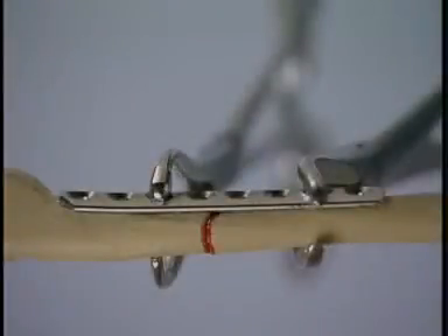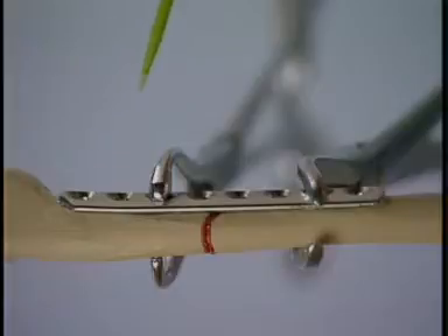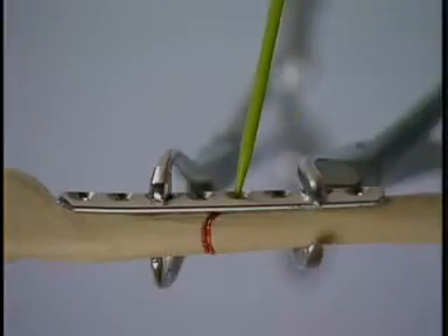The plate is attached to the bone with bone forceps. The plate holes at either end of the plate are filled first, followed by the holes closest to the fracture line.